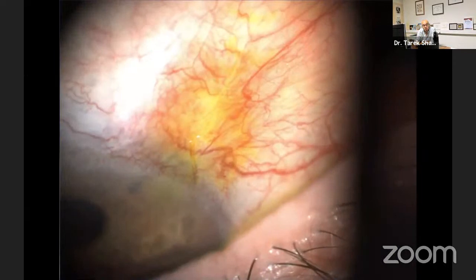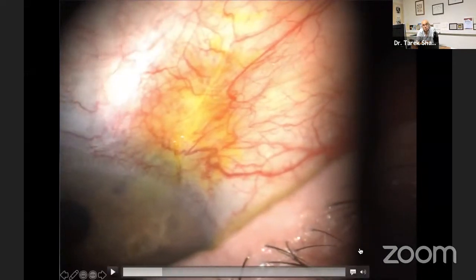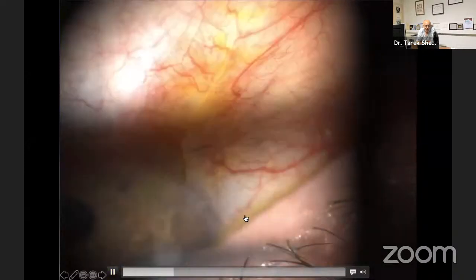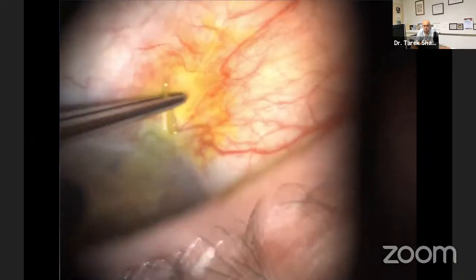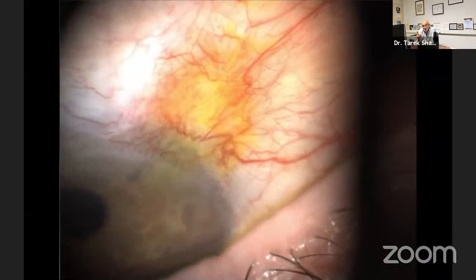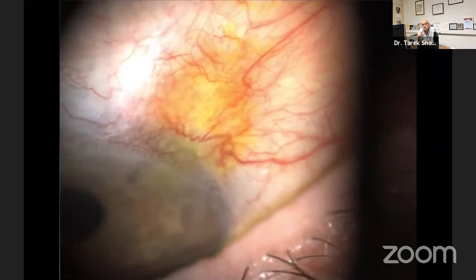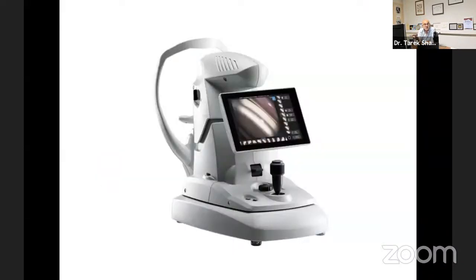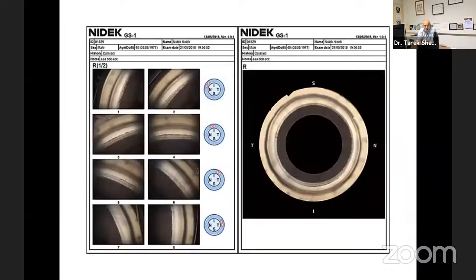A practice where you are not doing gonioscopy at least once a day is a loss. Here is a Xen implant that eroded through the conjunctiva — we retrieved it with tying forceps. Interestingly, the patient remained hypotonic even after implant removal. Gonioscopy provided the clue: the implant left behind a cyclodialysis cleft that required surgical revision to restore normal pressure.